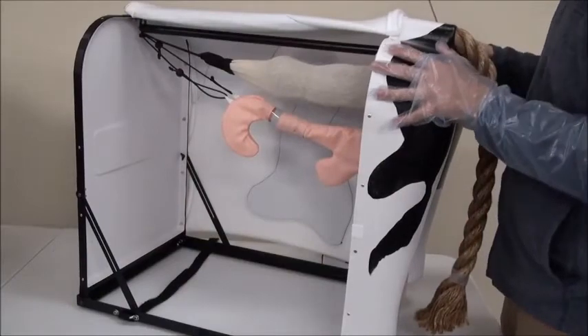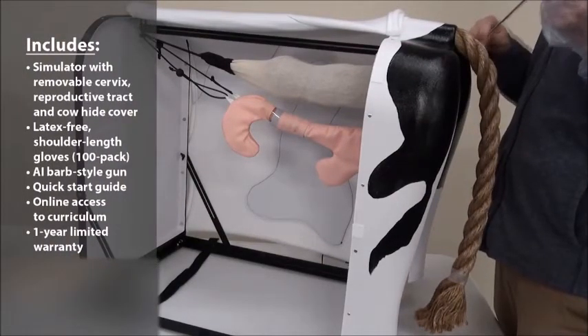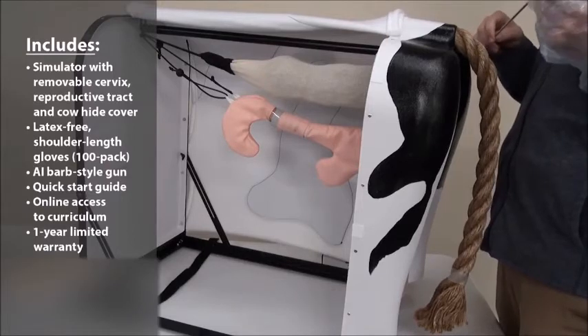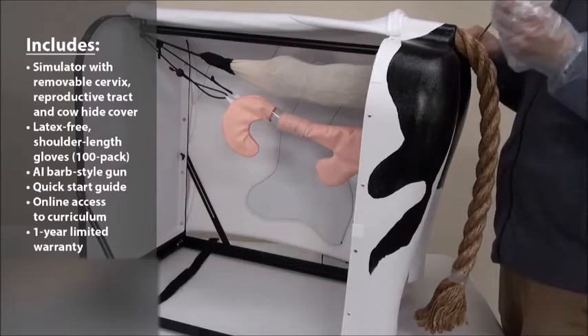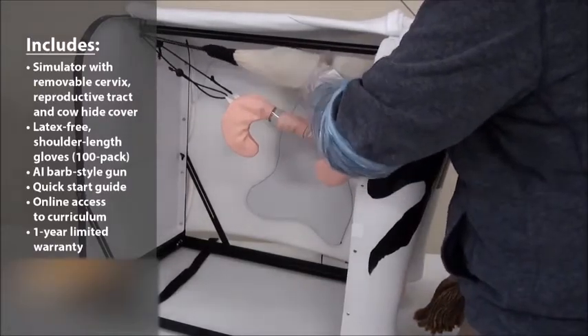The Bovine Breeder comes with a hundred-pack of shoulder-length gloves, an AI insemination gun, and also sheets for you to use within this product.